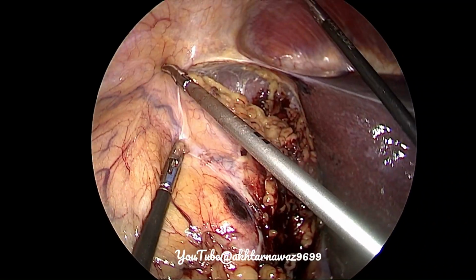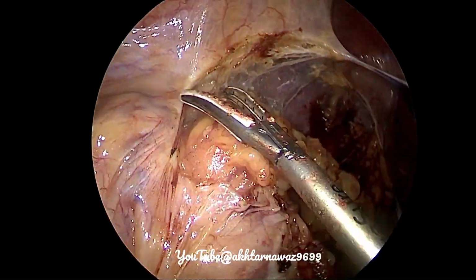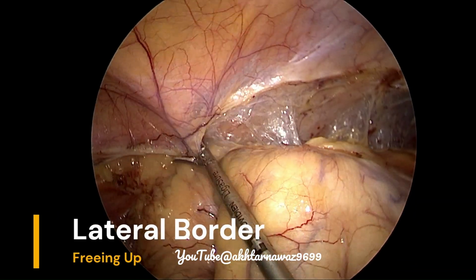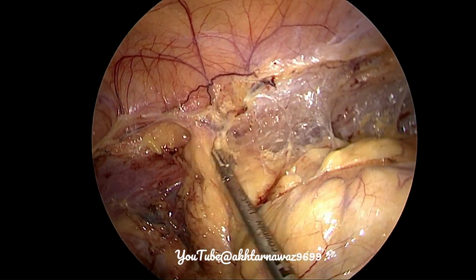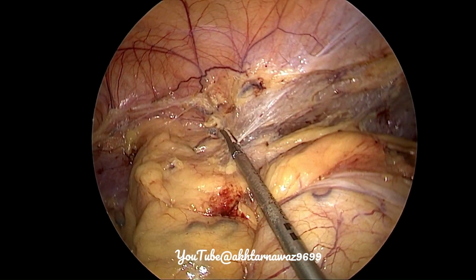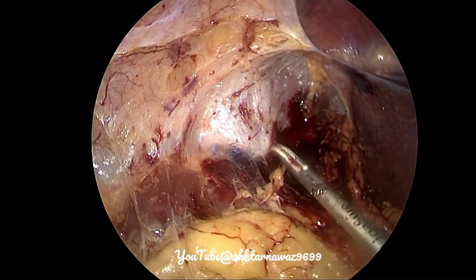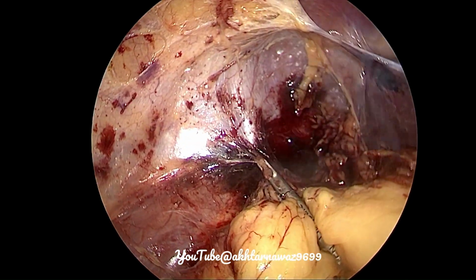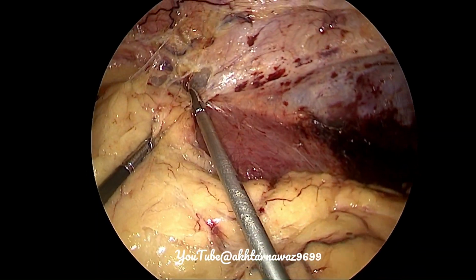Now is the turn to mobilize and free the kidney from the lateral aspect, as we have already dissected the posterior border of the kidney or the posterior surface of the kidney. It's really easily mobilized from the lateral aspect. So the dissection and mobilization of the kidney is now complete. The next step is to deal with the ureter.